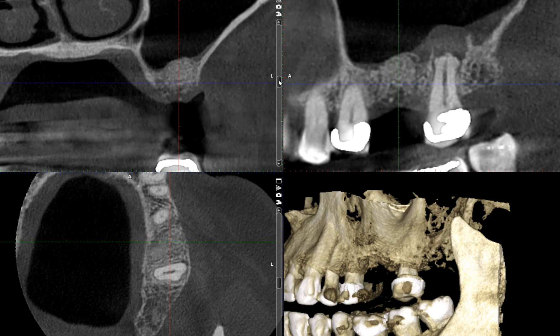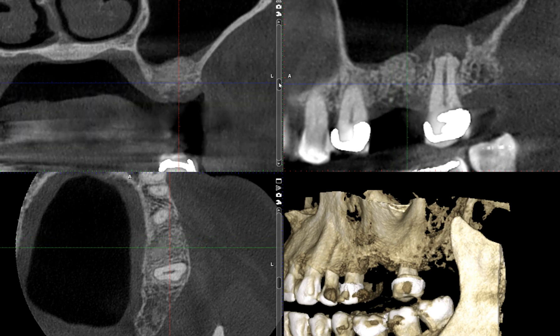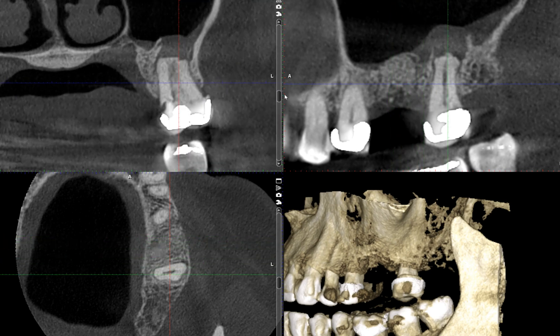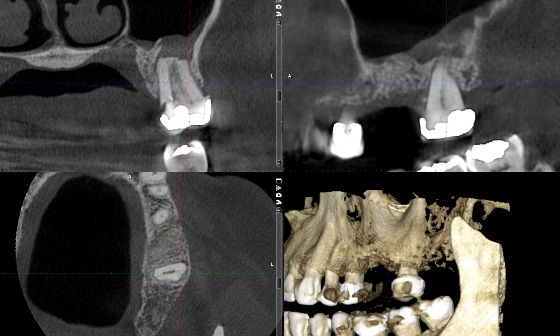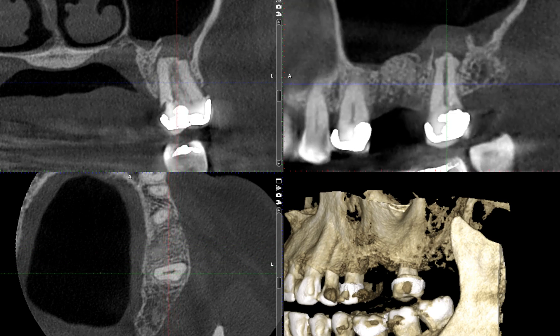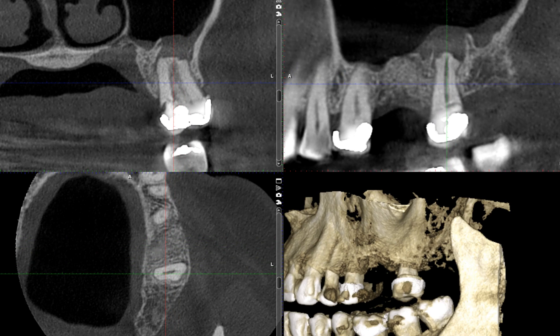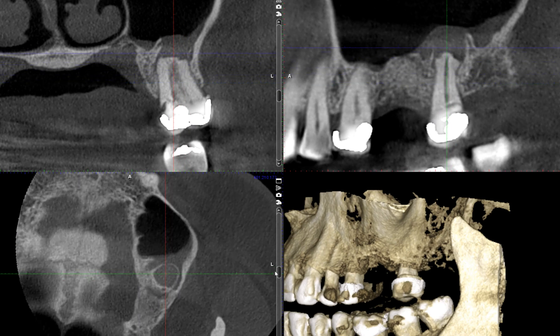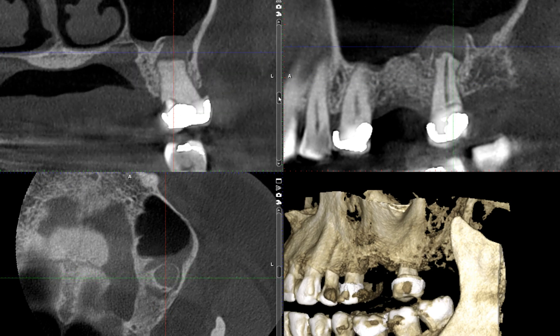Now let's go over to number 15. There are a lot of things that we can pick apart and recognize. First and foremost, here we have the crown that we saw previously.